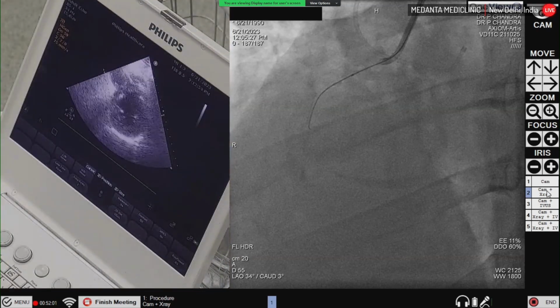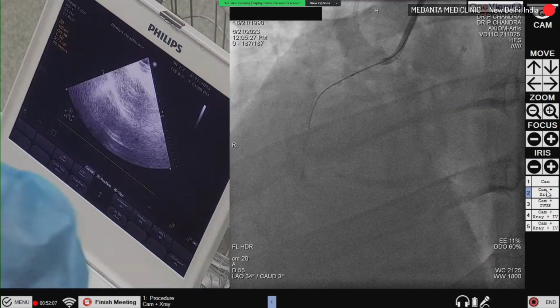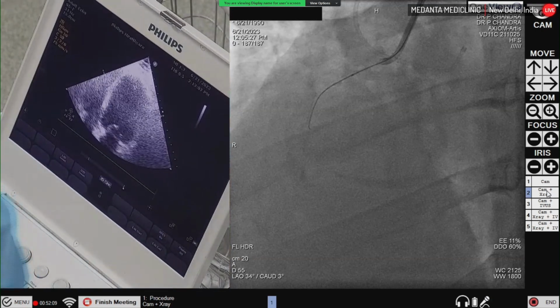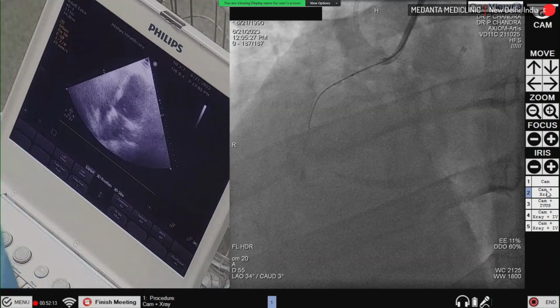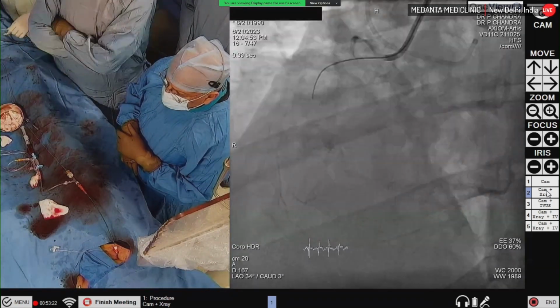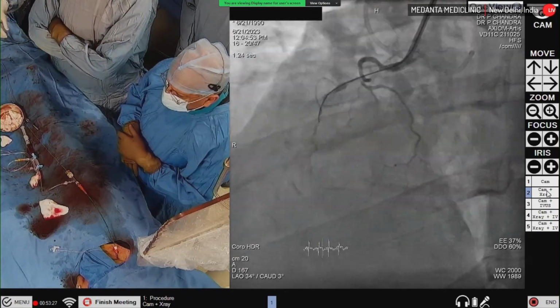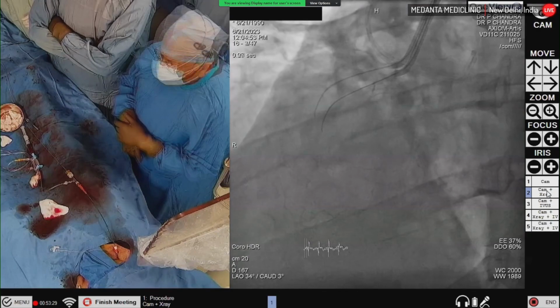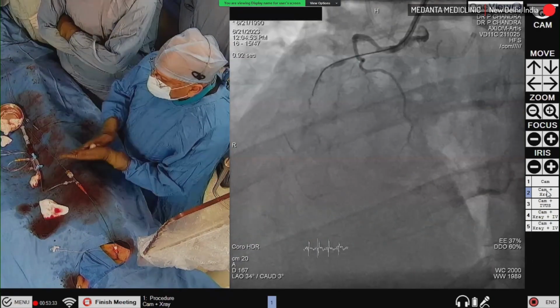No problems. We'll wait for 10 minutes because sometimes there can be a slow effusion. So we'll wait for 5-10 minutes.